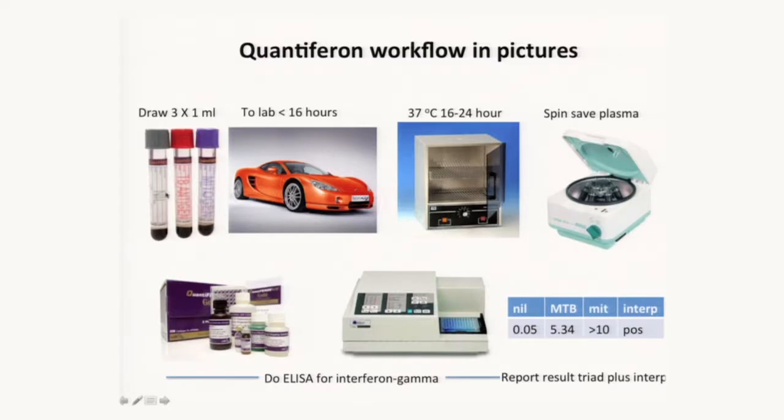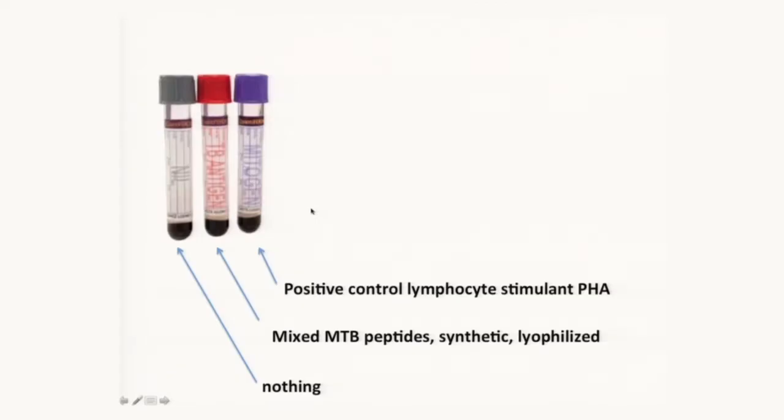With the chlamydia swabs and a few of the other microbiology tests we do, there's an expensive high-tech collection vessel, but usually it's just your standard purple top or marble top, or a sterile urine cup. So one of the pain points of this test is that these tubes have to be perfect, and we'll come back to that. The whole blood is drawn, there's anticoagulant in the tubes, you've got to get it to the lab pretty quickly, and then we'll go through this process a little bit step by step.